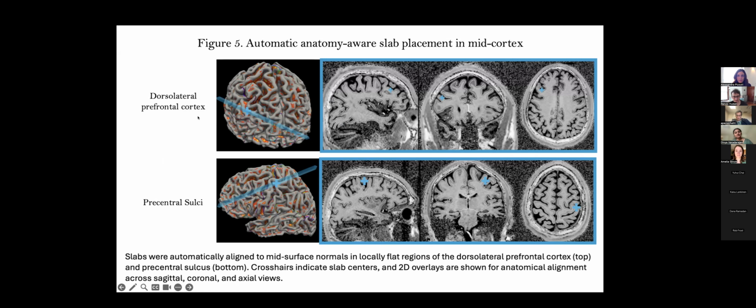And I think the DLPFC would make sense because it's used a lot for TMS, for example, where they use this in working memory. And you know what they do? They put the coil over the motor cortex and see until it twitches the fingers or the hand, and then they move 2.5 centimeters in front and a bit to the right or something. That's the scientific approach of finding DLPFC. So having a more scientific approach like yours would appeal to those people. I would not remove it. It looks fine to me as well.